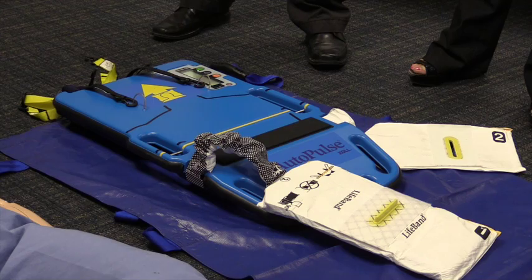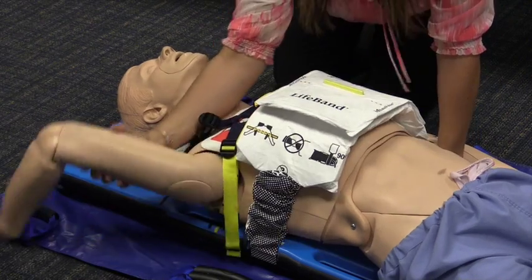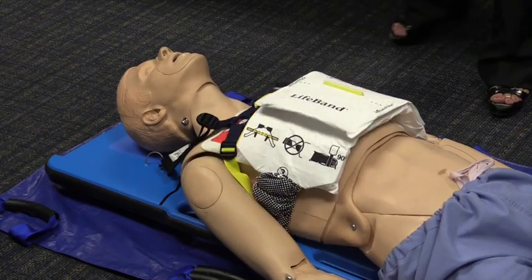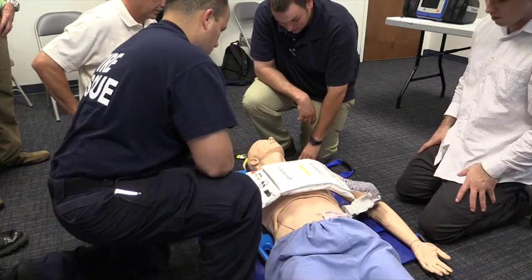This device is automatic CPR. It's a machine that performs CPR so you don't have to, and it actually recovers the heart's purpose and provides blood flow to the body to the extent that the heart was never in cardiac arrest.